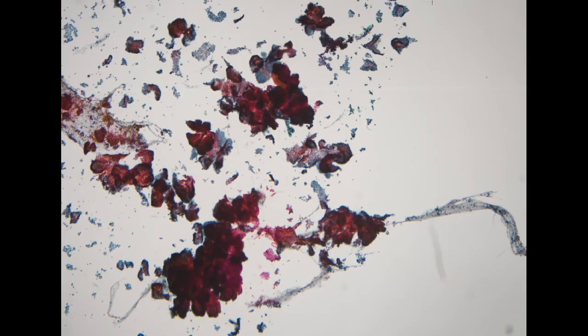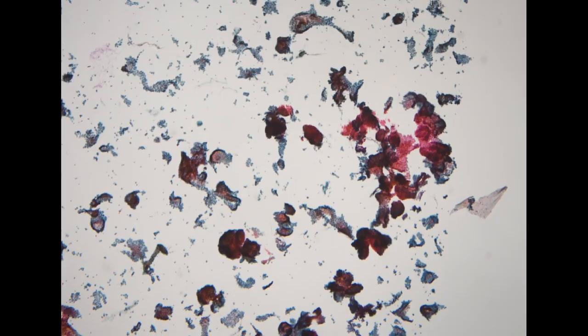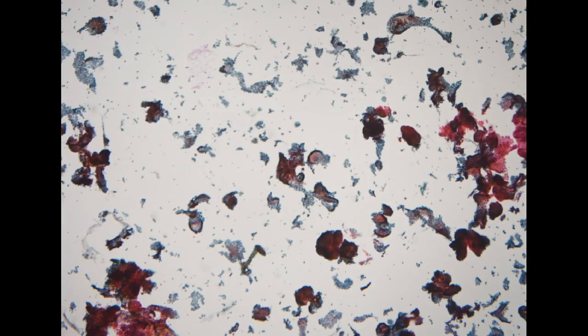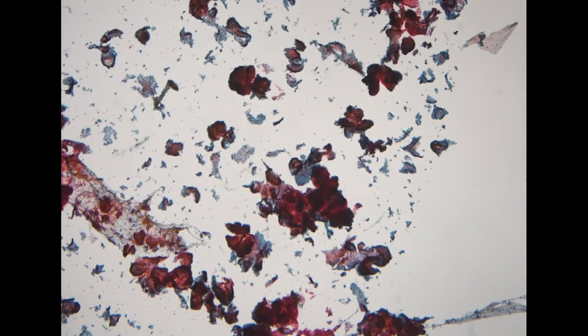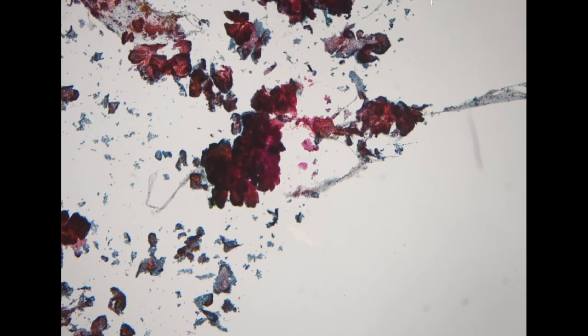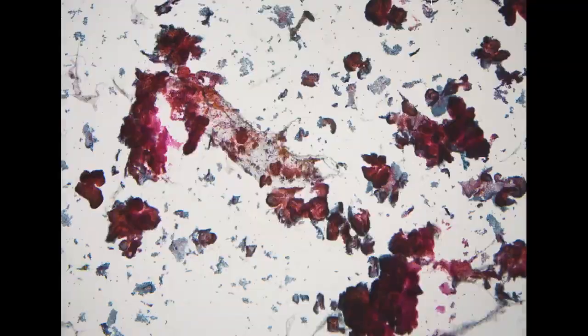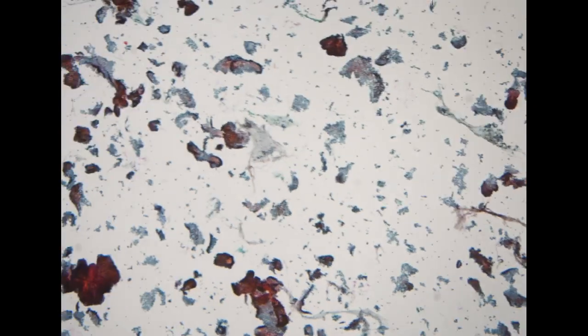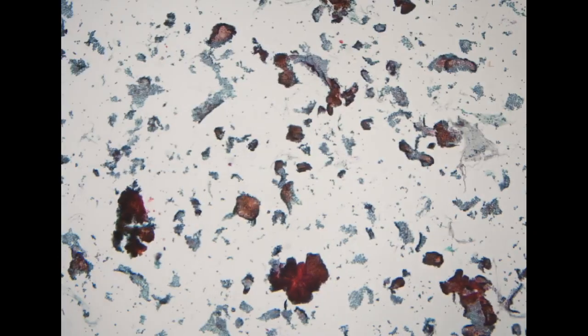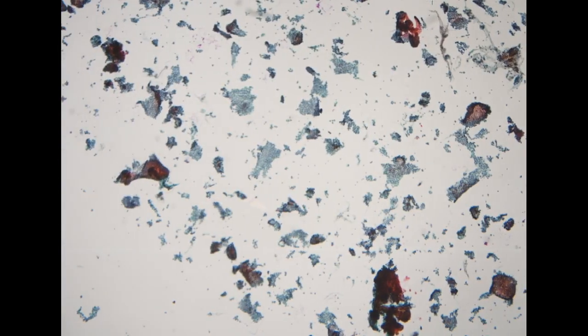The next specimen is a thyroid needle aspiration. On low power, this is very cellular, and we see flat monolayer sheets, but also some more three-dimensional papillary-looking fragments. And in the background, we do not see a lot of colloid. So this is likely a papillary thyroid carcinoma just on this very low power field.